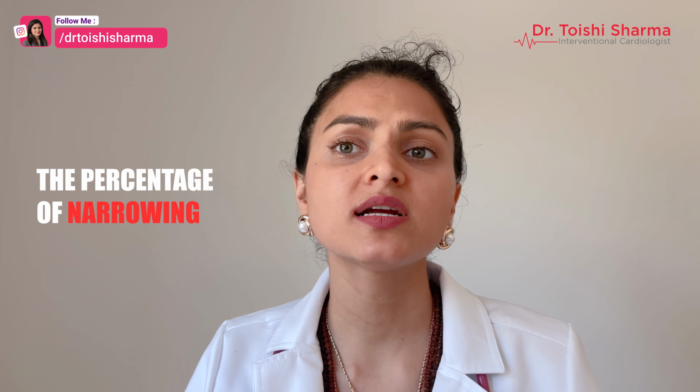An angiography is an X-ray test with dye that shows the coronary arteries, the blood vessels that supply your heart. The report usually mentions three things: Number 1, which artery is affected, like LAD, RCA, or circumflex. Number 2, it shows the percentage of narrowing or blockage. Number 3, it shows whether the blood flow is normal or reduced.